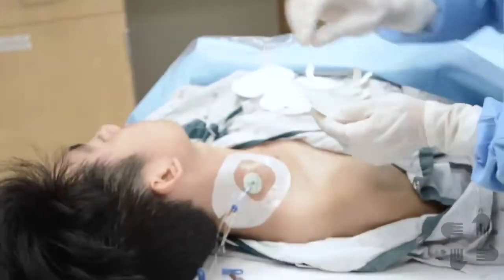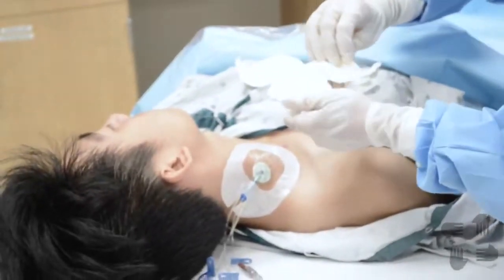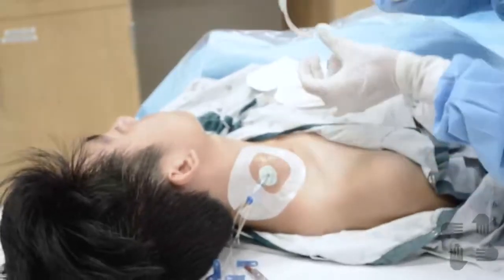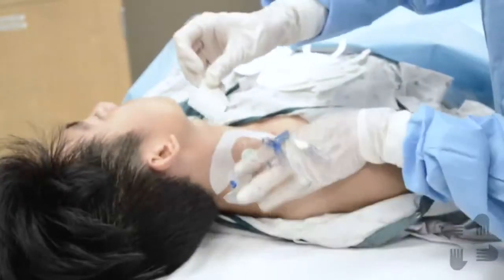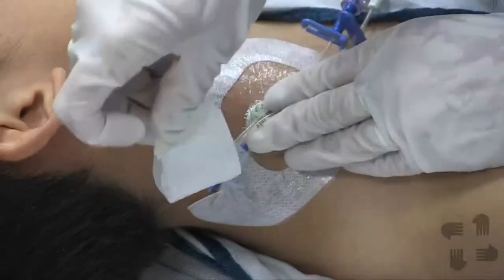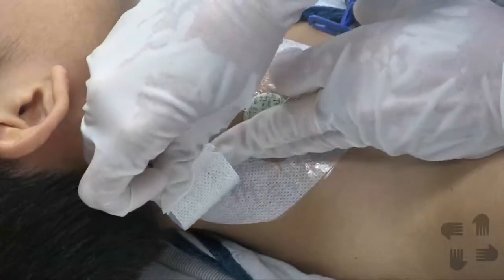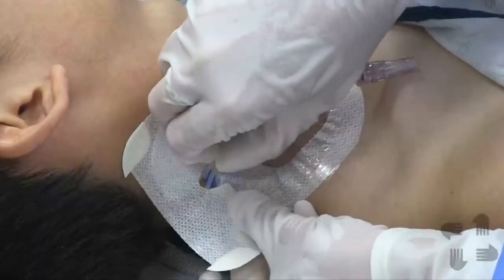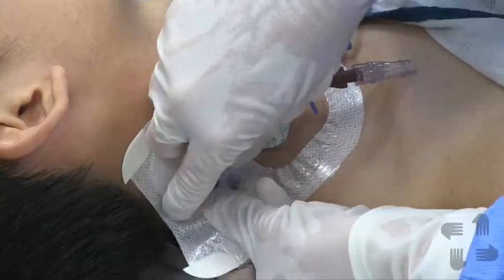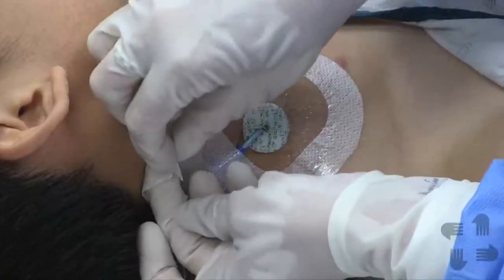So we'll take this second section, peel the backing off. You can also fold it in half if that will help you, by holding the tabs to get it secure. So I'm going to hold the line back, place the notch, matching the notches up, secure one side, and bring the other side through. Secure the other side, and then remove the two small tabs.